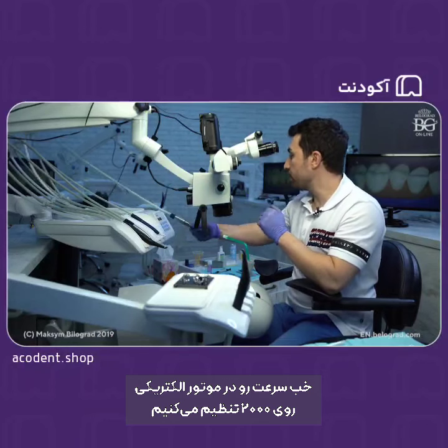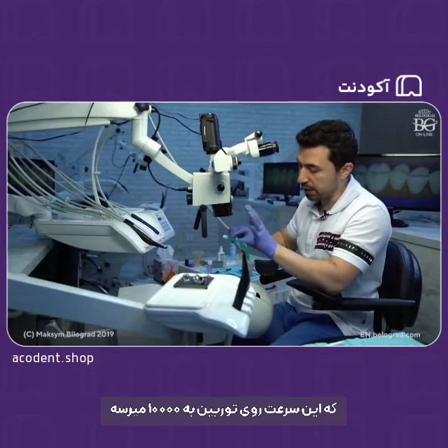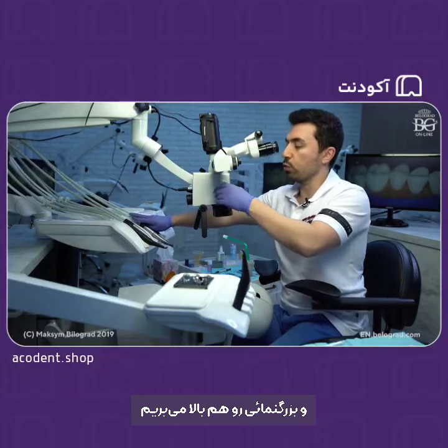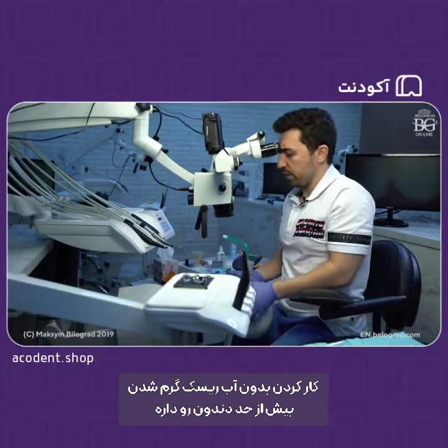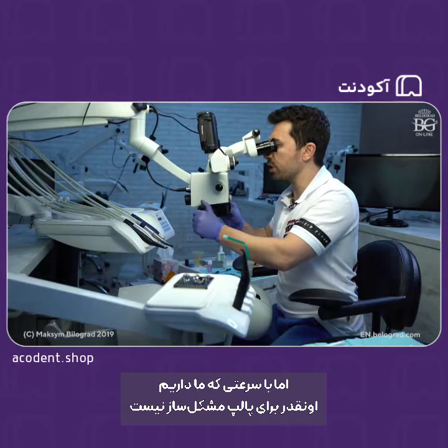Okay, we put speed 2000 on electric motor. With your increasing handpiece it will give you 10,000. So basically now we work with 10,000 RPM, no water, and we will work with pretty high magnification. Okay, working with no water, there is a sort of risk to make some overheating, but with that type of speed, which is 10,000 RPM only, it's not a big problem for pulp.